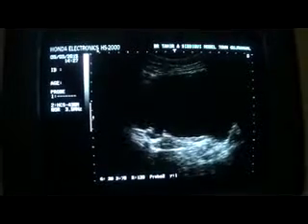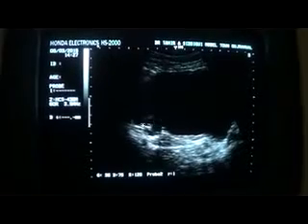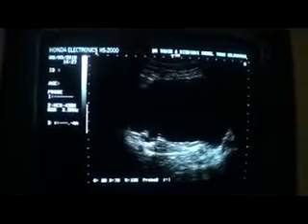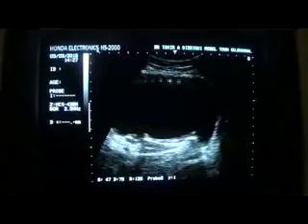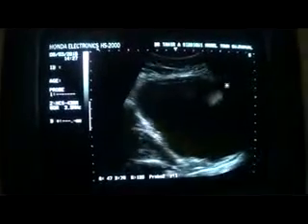It's protruding, this uretrovesical junction is dilated, protruding into the urinary bladder. This is the calculus. There is no wall thickening. The anterior wall that you can see is not thick. No hypertrophic trabeculae are seen. This is a magnified view.